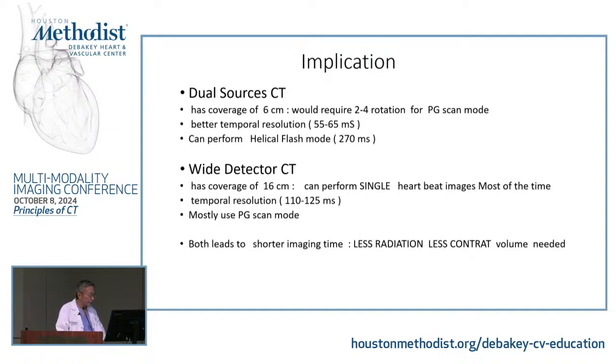Yeah, go ahead. So for dual source CT, the coverage is not 16? No, 6 centimeters. So that's only 4. If you have the first generation dual source, the coverage is only 4 centimeters, like a 64 slice CT. Just because it is impossible to fit. Imagine you have 2 sources and 2 detectors of 320. It would be a monstrosity. I don't think mechanically it's even possible, right?